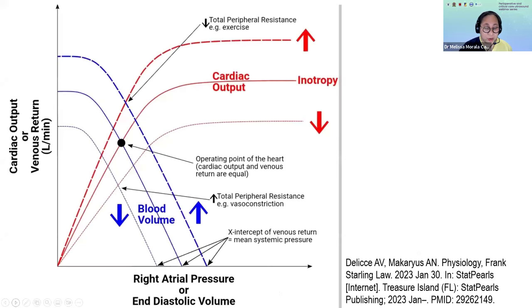Next slide. The purpose of point-of-care ultrasound to assess fluid responsiveness is to determine whether an increase in preload can still increase cardiac output in cases of circulatory shock. Now, we have to understand that circulatory shock does not equate with hypovolemia. In fact, it is well established that only about half of hemodynamically unstable patients are fluid responsive, and fluid responsiveness has been variably defined. The most common definition being an increase in stroke volume of 10 to 15% after 500 ml of crystalloid infusion over 10 to 15 minutes.